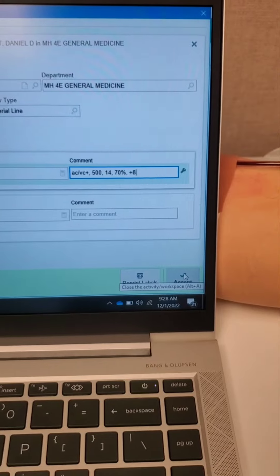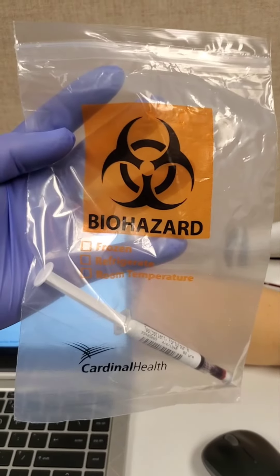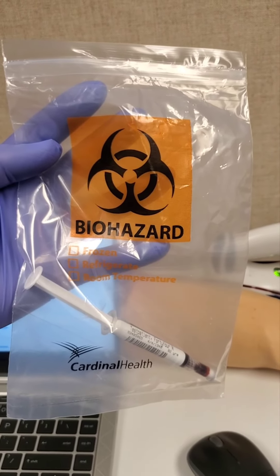Then document oxygen settings here as completely as possible. These are vent settings. Accept. Place ABG in biohazard bag and send to lab. That's it.